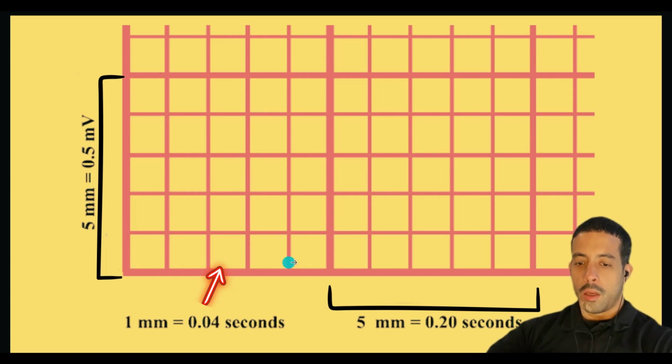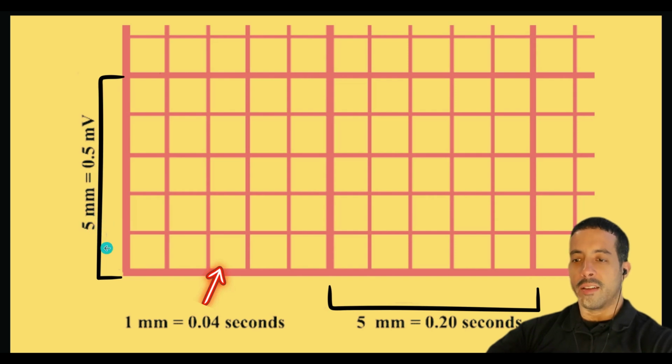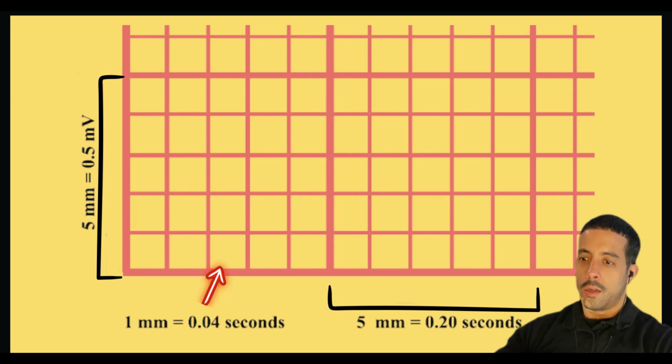The amount of time is what we put the most emphasis on for the 3 leads, which are the ones that we just went over, the slow heart rate and the fast heart rates. Now, when we talk about ST elevation, that information is also very important, but we also think about the millivolts, not just the seconds. And remember, the millivolts are also a measurement of energy. And what is energy? Energy can be considered a contraction. Remember, the action potential of the heart is not just electrical, it's also mechanical.